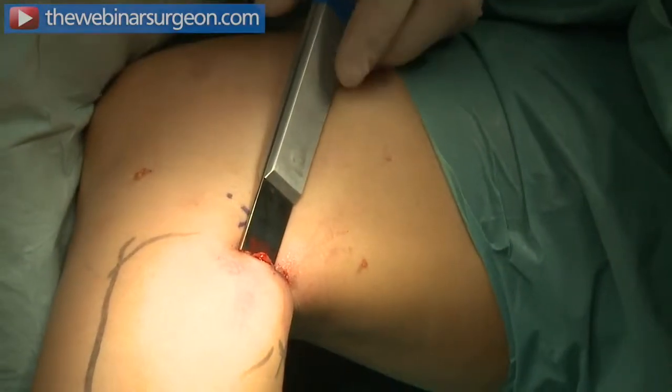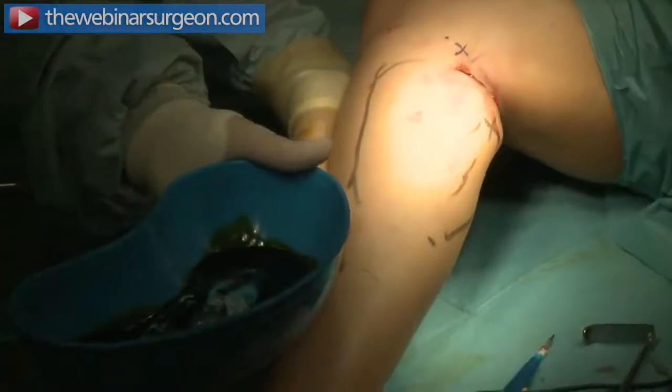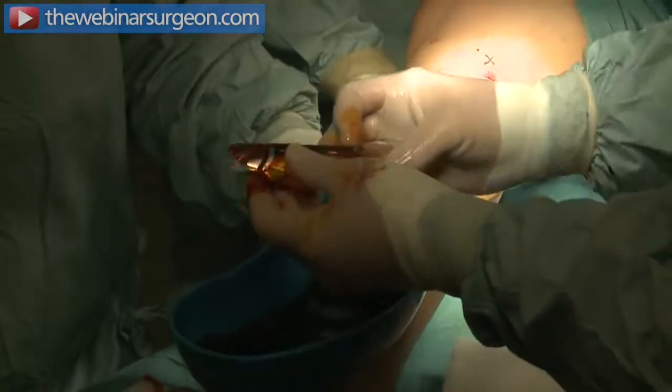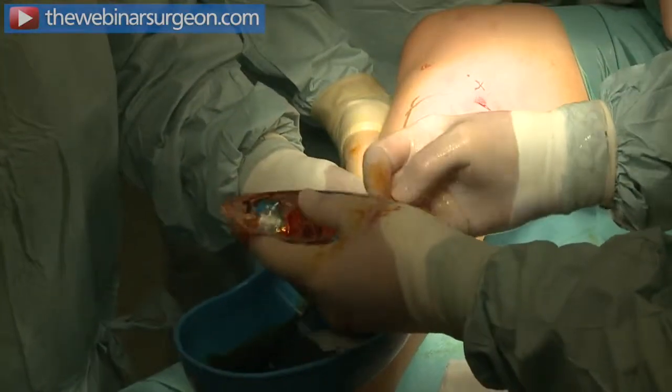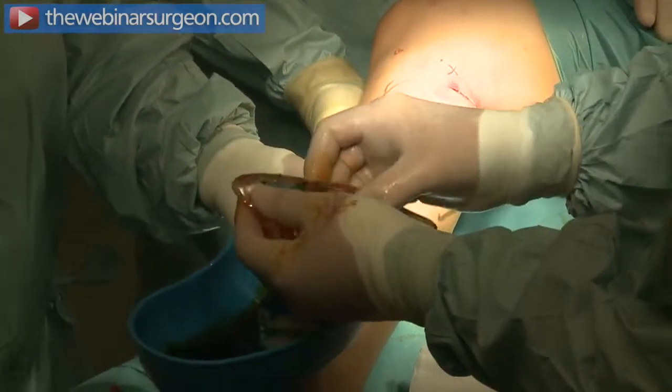Don't push down any further, just keep it at the tip. This is not a big implant — looks like a little sausage. There's a little teflon patch at the top; in theory you can actually take that and use it to pull it down with.